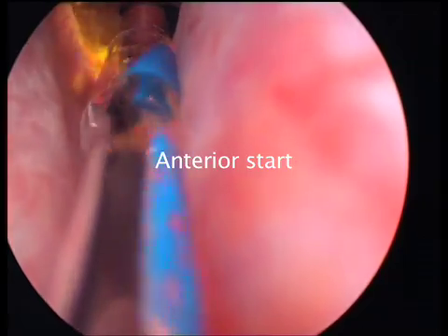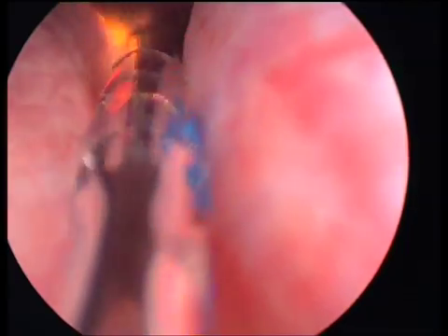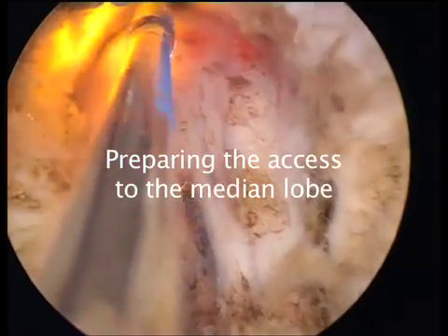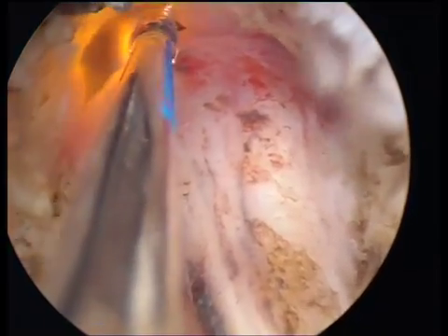I like to start anteriorly, creating a tunnel that will allow the cystoscope to move inside the prostate without causing bleeding. Once this tunnel is created, additional space is developed before attempting to treat the median lobe.